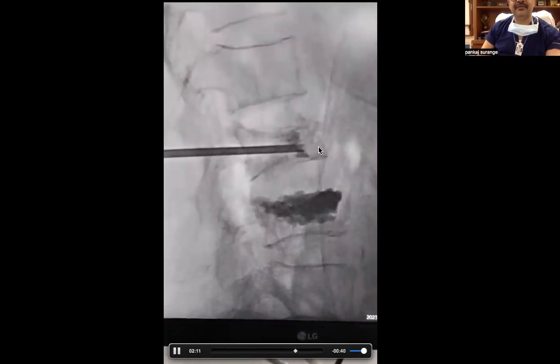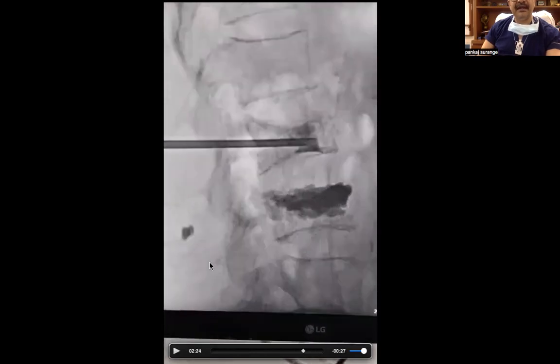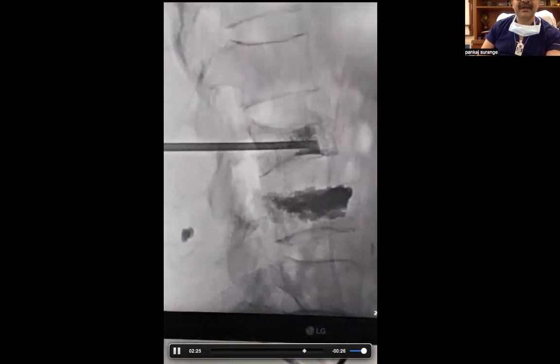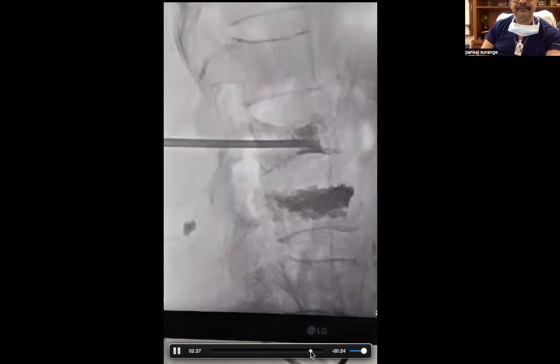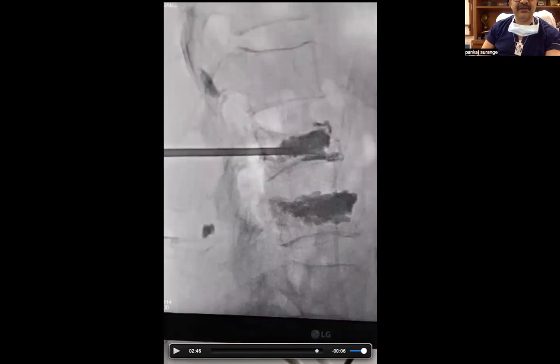But this is how we are filling it. Again, this is not leaked cement. This is just cement which is outside. And you can fill this entire vertebral body. This is just a simple case of vertebroplasty.